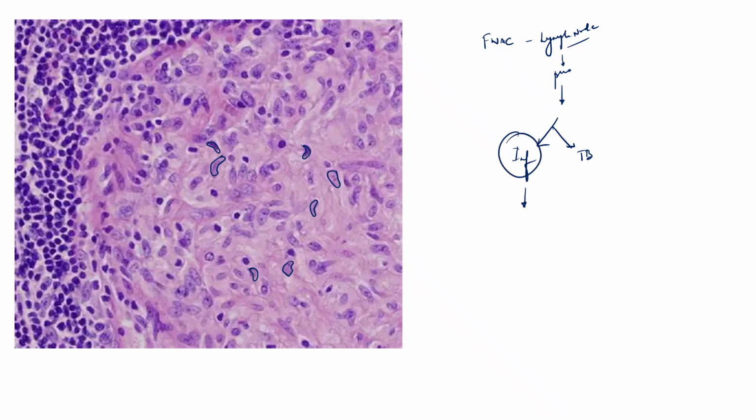In infection, you will get neutrophils, a lot of neutrophils, a lot of degeneration, which does not look like caseous necrosis at all. Neutrophils accompanied by macrophages and a few lymphocytes. But when it's TB, you start getting necrosis plus plasma cells plus lymphocytes plus epithelioid histiocytes plus giant cells.